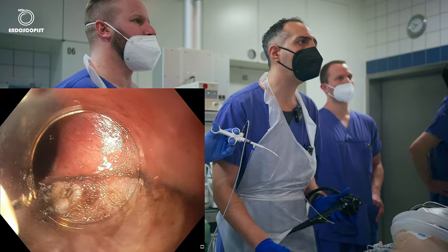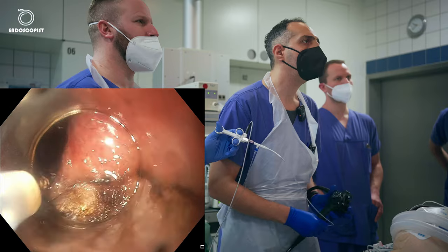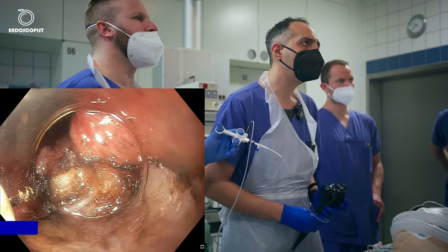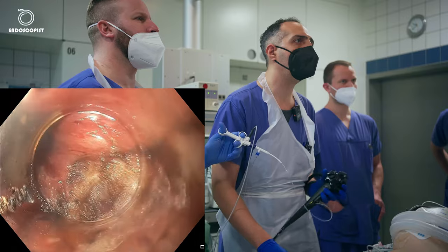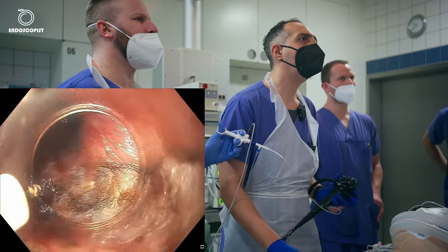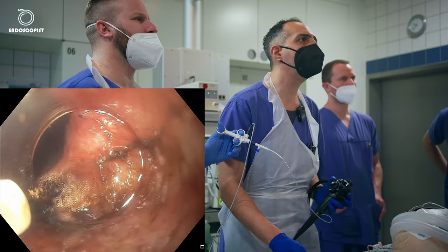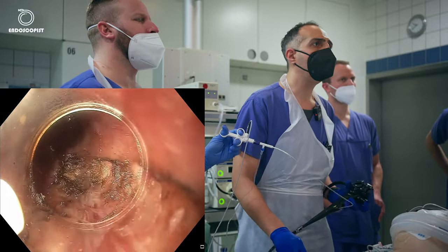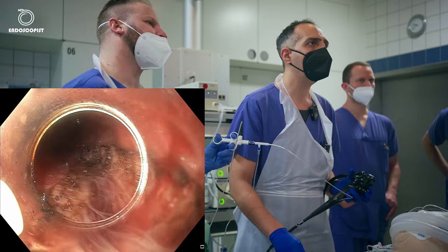So I will cut something like 2 centimeters from the stomach. That looks fine. I will cut this. Very nice. We have here the serosa behind. Okay, I think this would be our last cut here. It's fine. So I think we finished our myotomy. We will refine the myotomy. Now we can see here the longitudinal fibers, which we leave in peace.